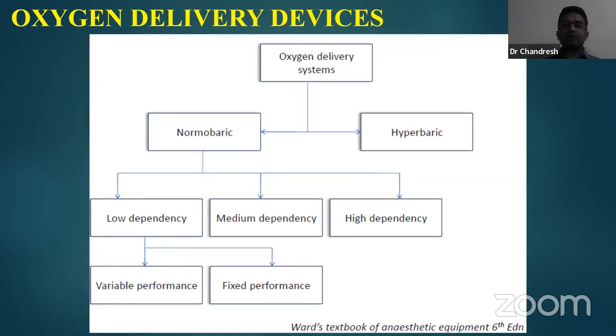I will explain these five terms to you so that whenever you touch any oxygen delivery device, you should think about whether you are dealing with a low, medium or high dependency device, and whether it is a variable or fixed performance device. Next slide.